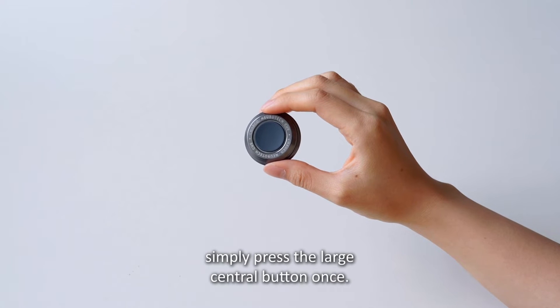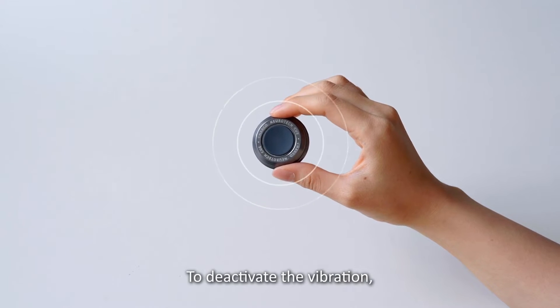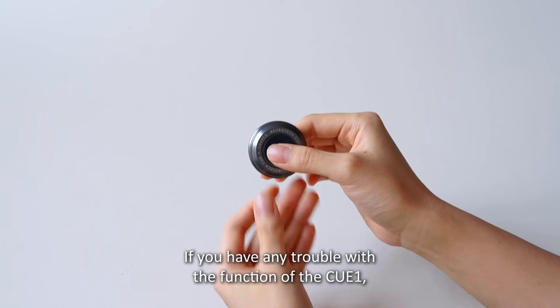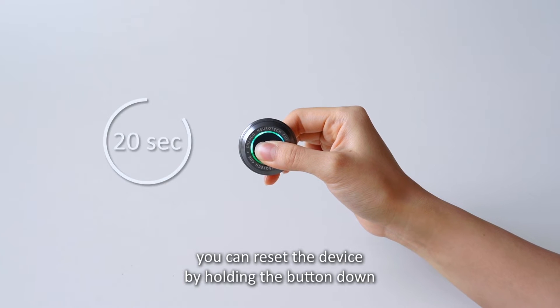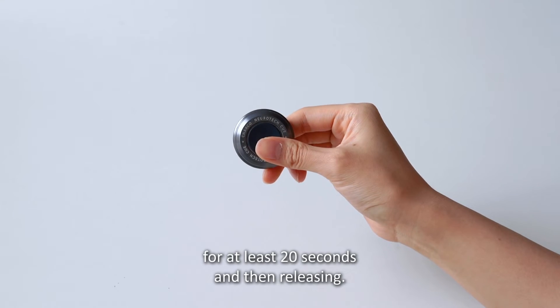To activate the vibration, simply press the large central button once. To deactivate the vibration, press the button again. If you have any trouble with the function of the Q1, you can reset the device by holding the button down for at least 20 seconds and then releasing.